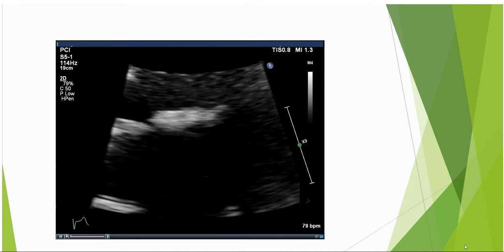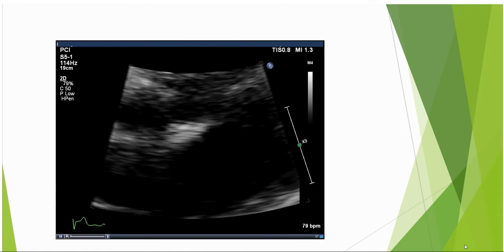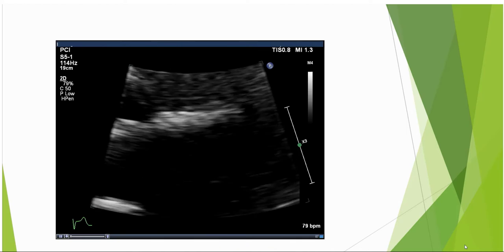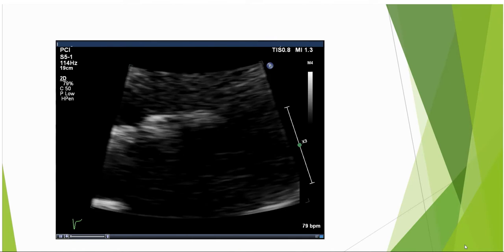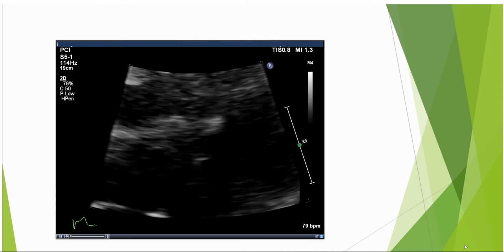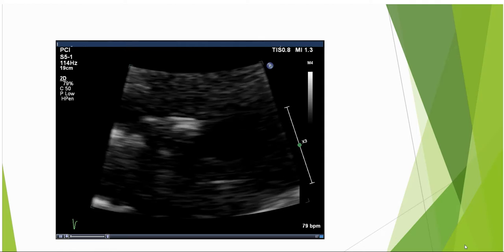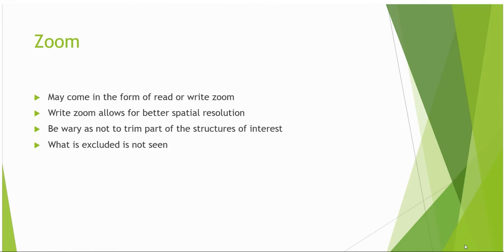In this example, we can see that a tight zoom box has been applied. The frame rate has increased significantly. However, the box is so tight, it's actually hard to identify what we're looking at. Enlarging the box will allow for more detail to be shown and provide landmarks, while frame rates should still remain high.